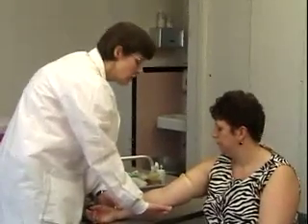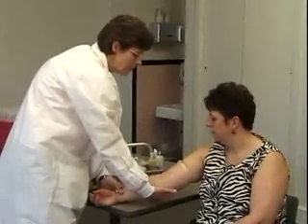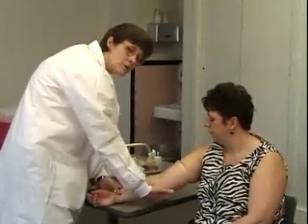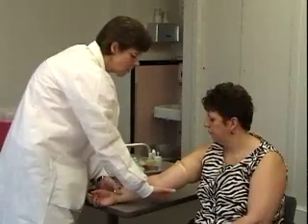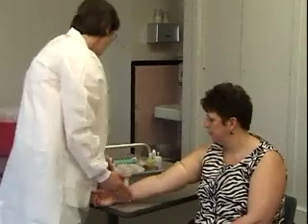You want to make sure that the patient's arm is in a good position. There are sometimes things that you can put under their elbow — a roll of paper towels, a rolled up towel, or a rolled up blue pad — which sometimes makes good padding for support under the patient's arm.